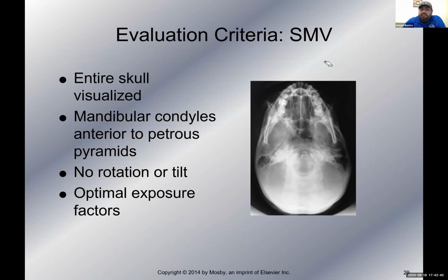How do we determine tilt? We're looking at the distance from the mandibular rami to the lateral cranial cortex. So again, this is my right side, this is my left side. The left side looks a little bit bigger there. So if that left side got bigger, what happened? We have tilt. But which way was it tilted? We always look at the vertex. When we're looking at tilt, we look at the vertex. Which way was the vertex tilted? The vertex was tilted to the left.